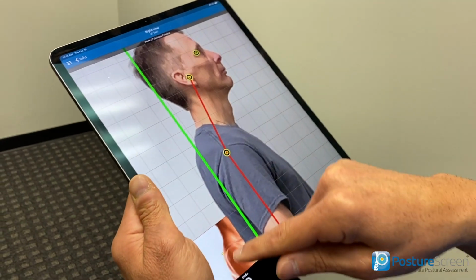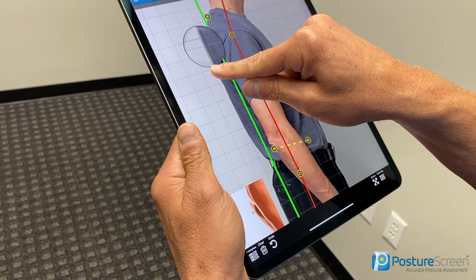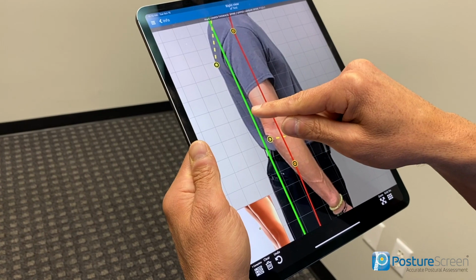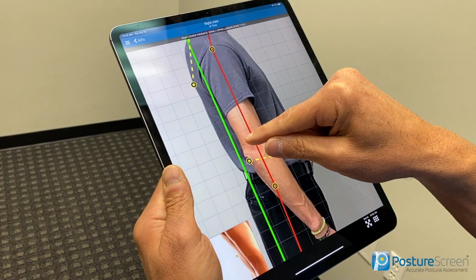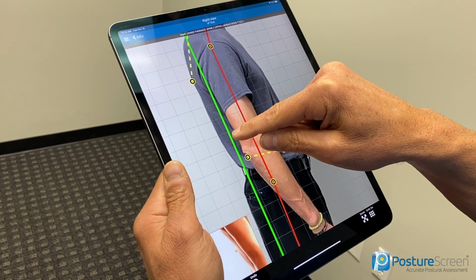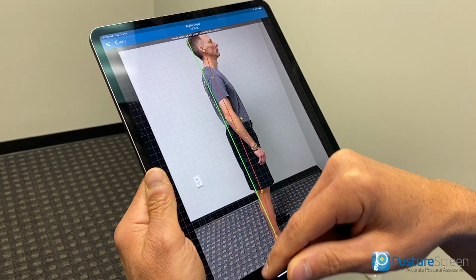I'm going to now click the additional points. So it wants us to click C7, T1, the thoracic kyphosis. Now, since he's in a baggy shirt, I can't see where the endpoint is around T12 to L1 like it says. Usually that's around the elbow level if you're a decent distance apart. And I know since I've worked on Tim before as a clinician that he's fairly thin, that his back would be right about that area.